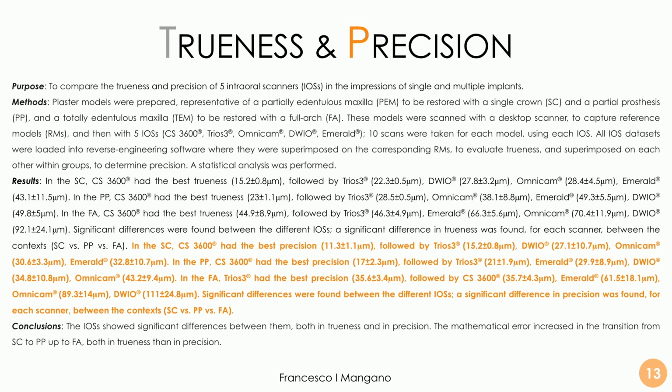But obviously there are a lot of studies, in vitro and also in vivo studies, on the precision. Usually the studies focus their attention on trueness and precision, so the accuracy. In 2019 I published this study comparing 5 different intraoral scanners in different simulations of application: the single implant, the bridge, and the full arch.